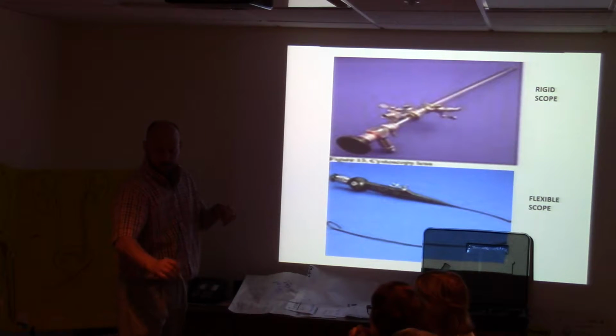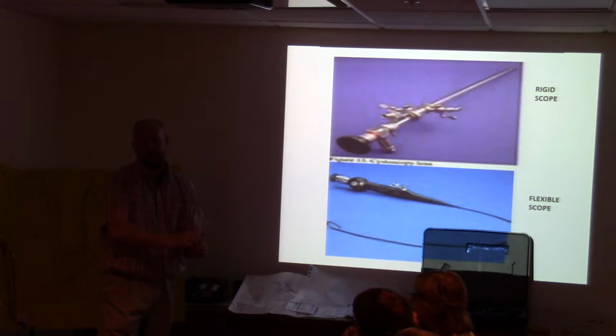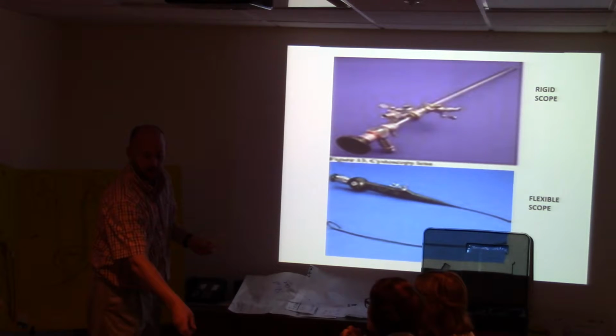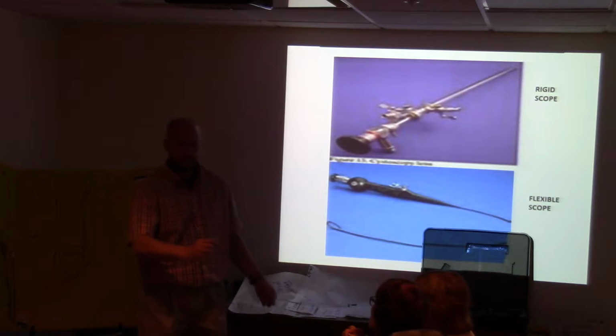Then he'll tell the scrub tech, okay, you can put the stent on now, or you could put on the catheter, and it's that person's job to do this while it's in there, because if you pull back, you'll pull it out of place. So the x-ray tech makes sure it's placed in the kidney the whole time and it's not pulled out using x-ray. And the scrub tech's job is to feed this over that without pulling it or dropping it, and then holding the wire, and then the doctor will take it from there and push it in and do the rest of the work.